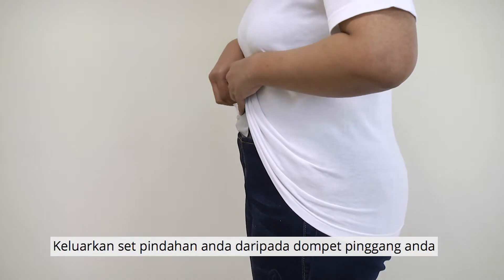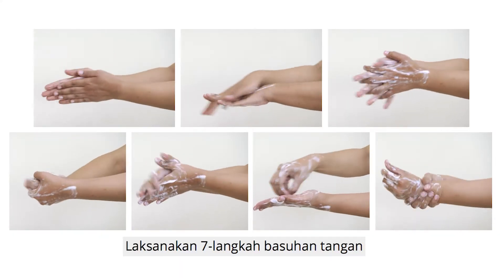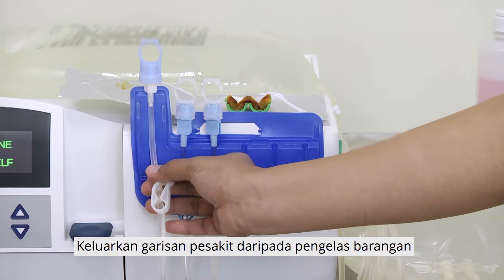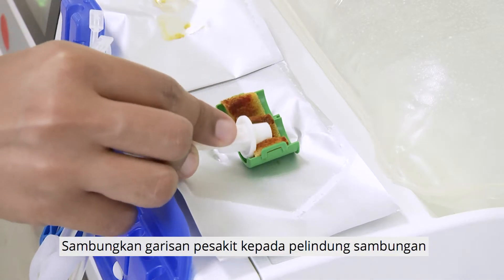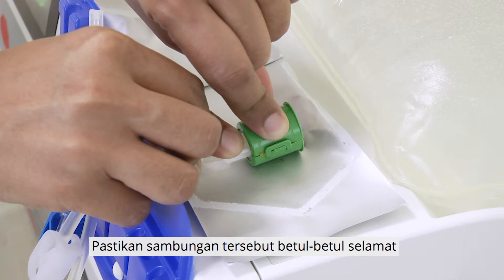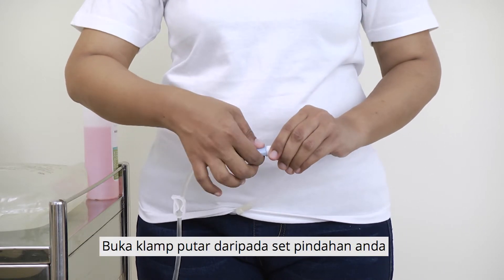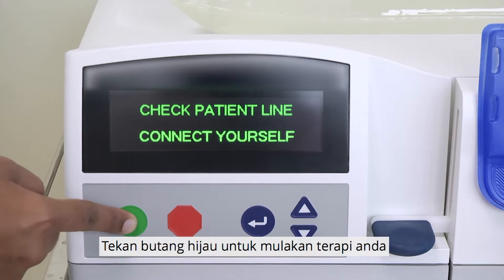Take out your transfer set from your waste pouch. Perform the 7-step hand washing. Dry your hands completely with a clean paper towel. Open the connection shield. Remove the patient line from the organizer. Remove the blue pull ring from the patient line. Attach the patient line onto the connection shield and ensure the connection is firmly secured. Remove the mini-cap from your transfer set carefully and drop it. Connect the patient line to your transfer set securely. Open the twist clamp of your transfer set. Open the clamp on the patient line.